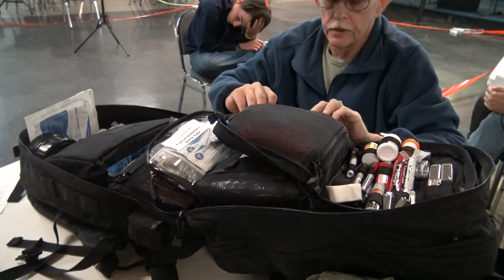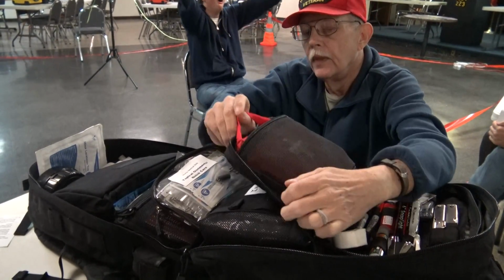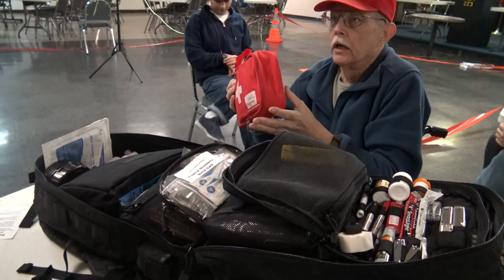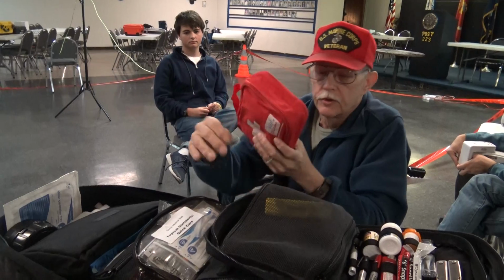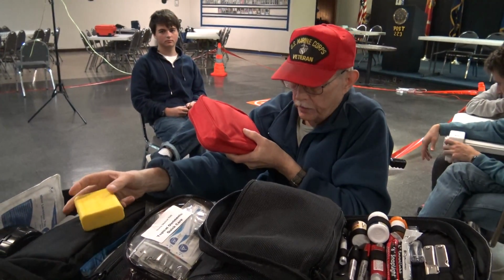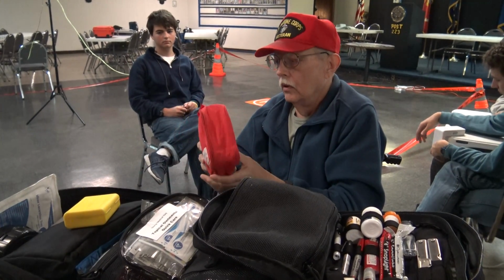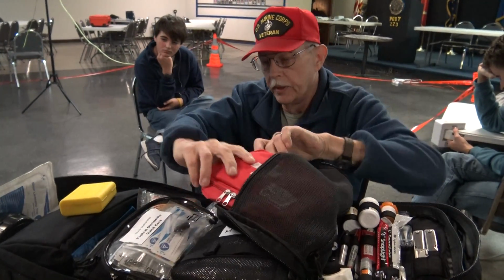All right, and let's see. This one is, like I said, I've got all the typical stuff you'll find for minor cuts and bruises in here, just Band-Aids and stuff. This, y'all already probably know what it is. It's an extraction kit. It'll suck out venom or bee stings, you name it, it pretty much handles it.